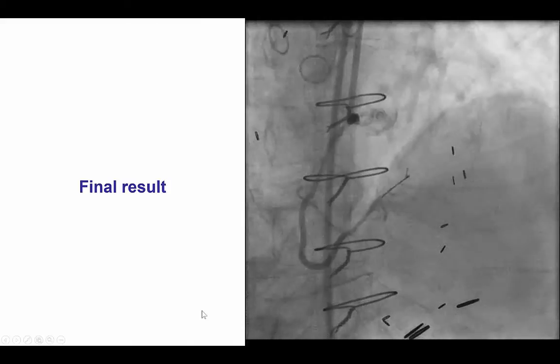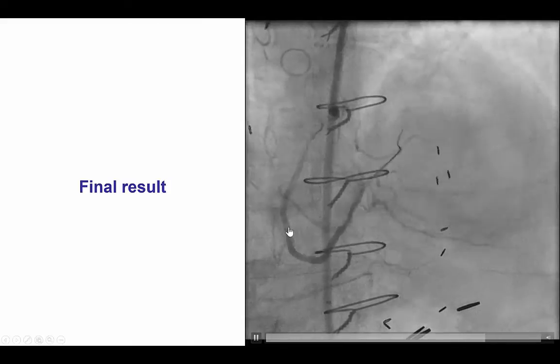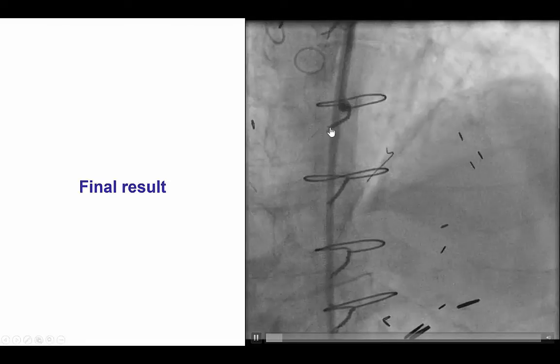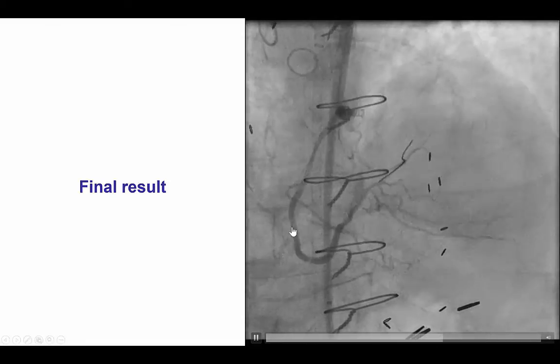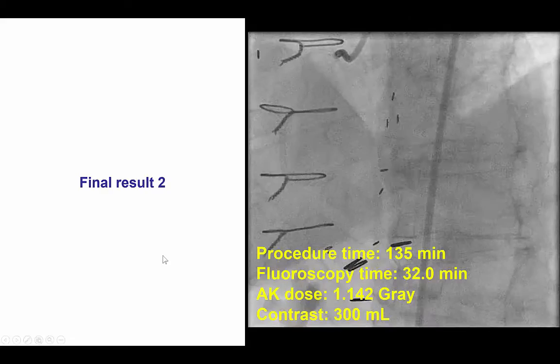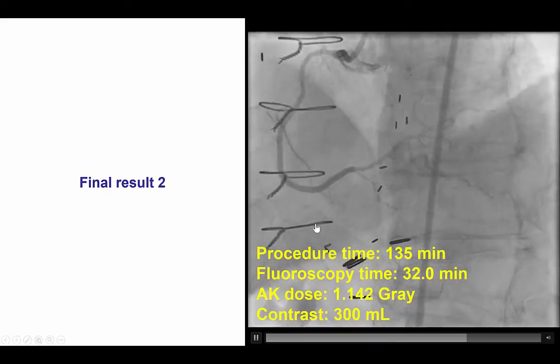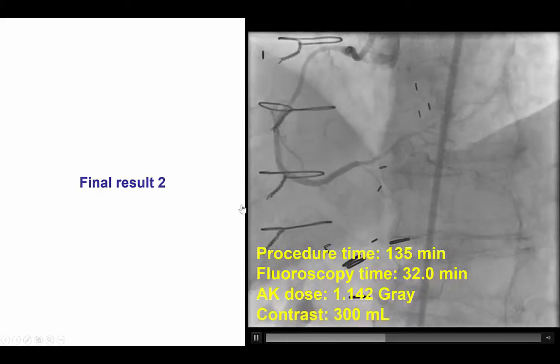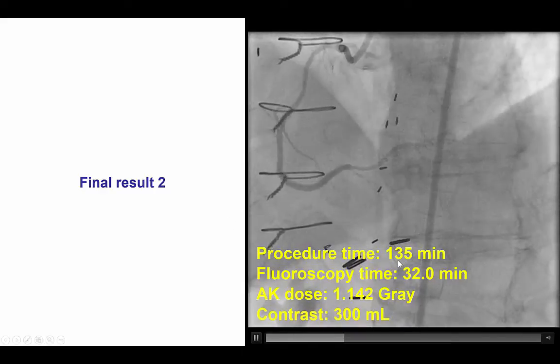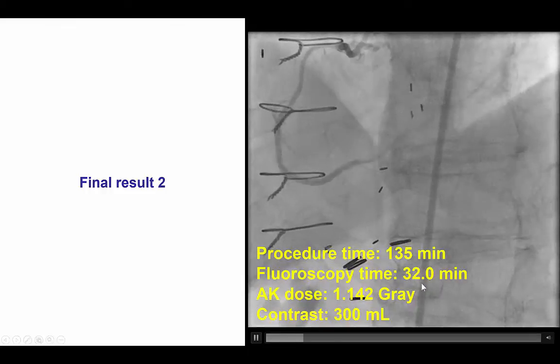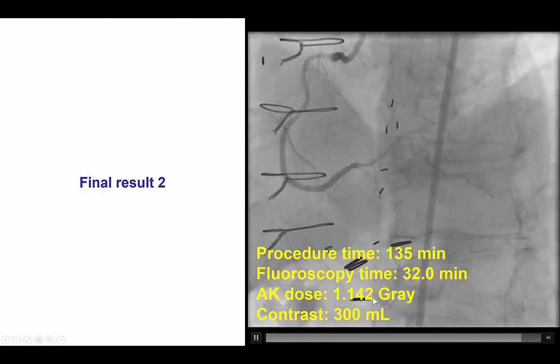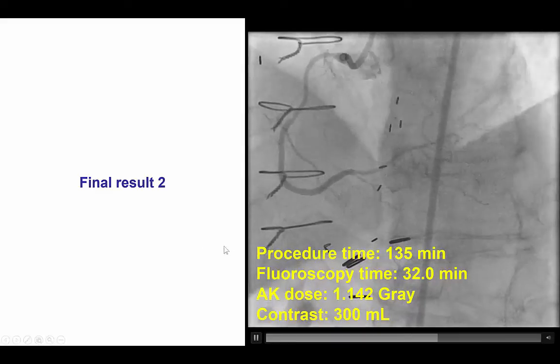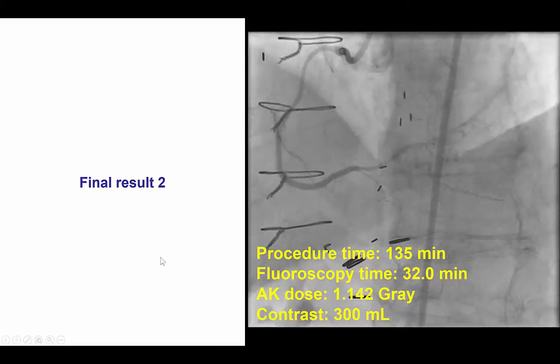That led us to place an additional stent on the distal cap, which provided an excellent final result with TIMI-3 flow. We elected not to stent the proximal part of the RCA, although it did have some disease, and instead left it alone. The patient had an excellent result with resolution of his symptoms. Procedure time was 135 minutes, fluoro time 32 minutes, and air kerma 1.1 gray with 300 ml of contrast — a fairly efficacious and efficient use of resources.